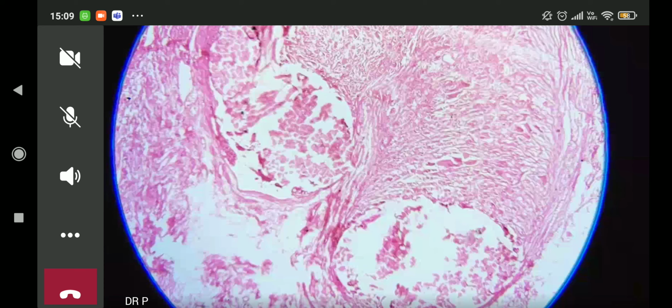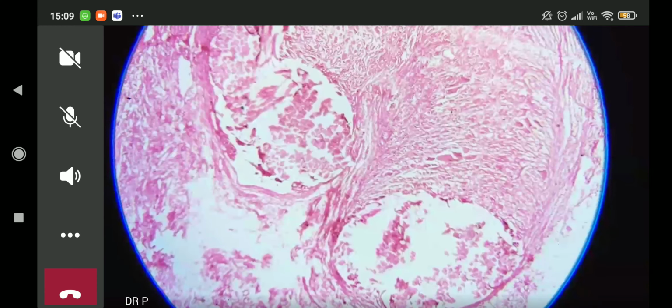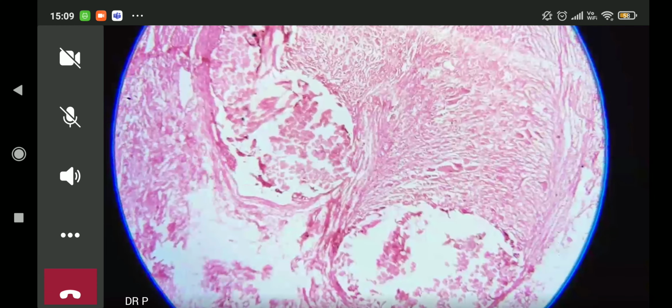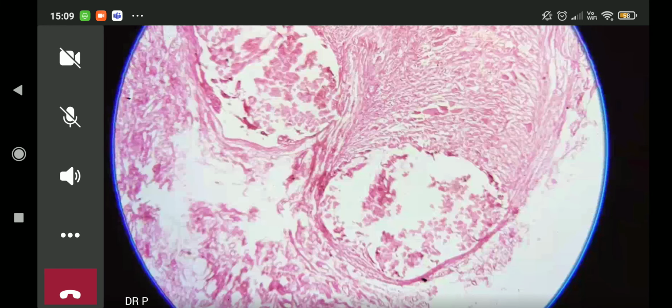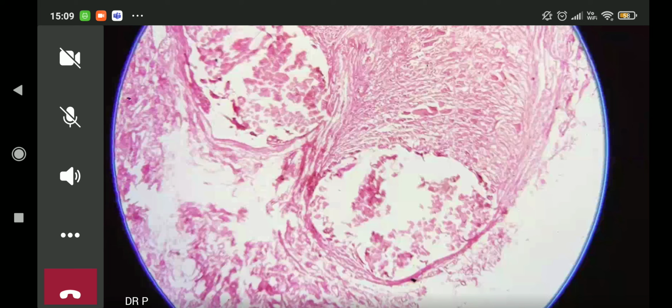So children, this is nothing but something called a foreign body granuloma. The earlier granulomas that I showed you in the lymph node were composed of fibroblasts and modified macrophages and a sprinkling of lymphocytes. Now, this is also a granuloma, a collection, but it's a collection in which you very frankly can't see any cells.